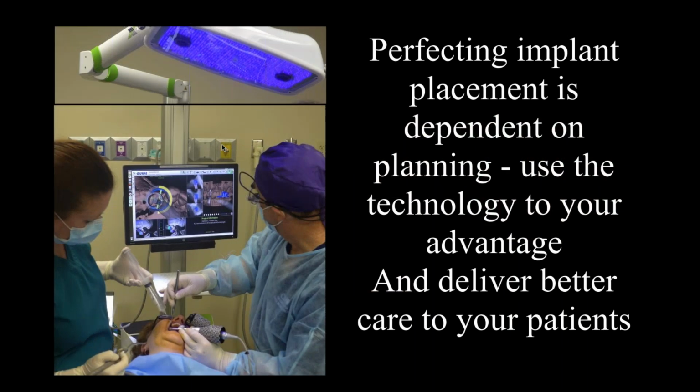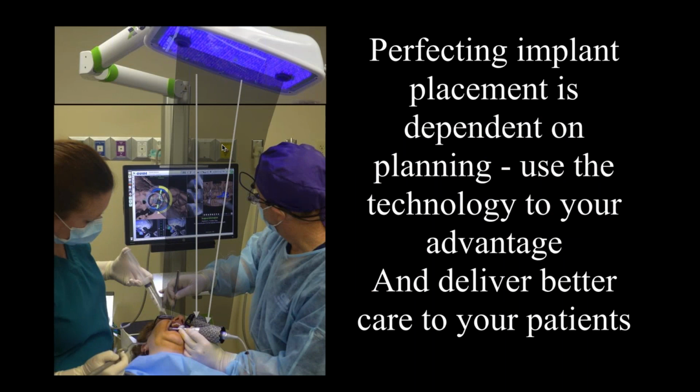Now, when you're doing the implants, this is the way this works. You can see the blue light above, and the technology is good because now the lights shine down, and off of the handpiece and the patient tracking array, then the light bounces back up and into these high definition cameras here. And then you have the image on the screen.